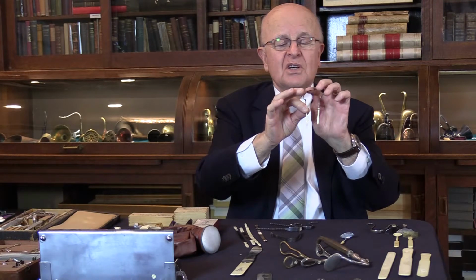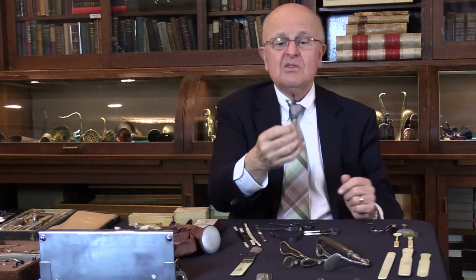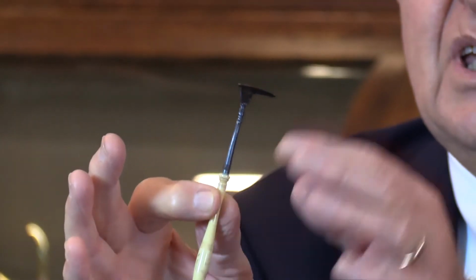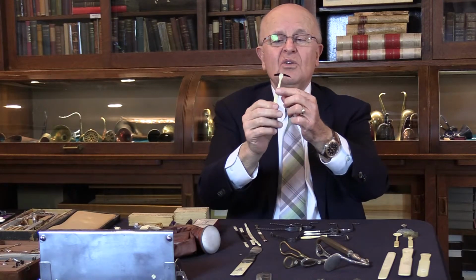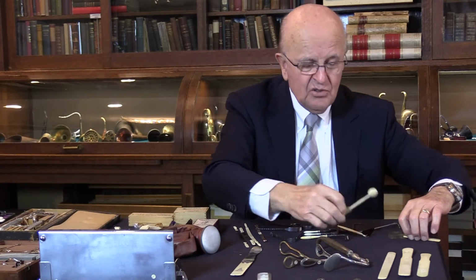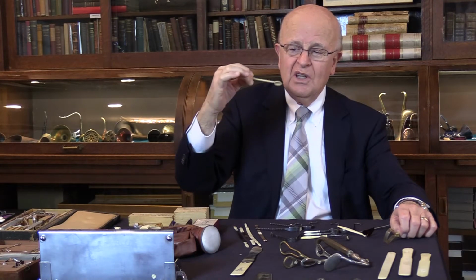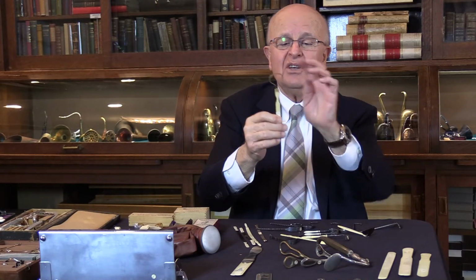It's brass here with ivory handles to scrape the tongue. I thought this is clever, straightforward. Again, ivory handle and another scraper. This is ivory handle with plastic here. Same thing here, but metal. I thought these are interesting. This is one of the earliest ones. Again, it's ivory. It's like a spoon that you can scrape the tongue with. Same thing, ivory with plastic here.